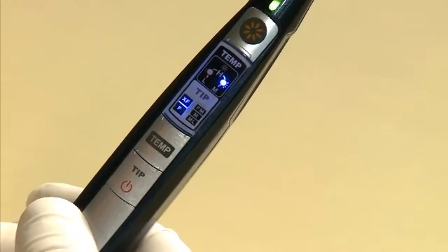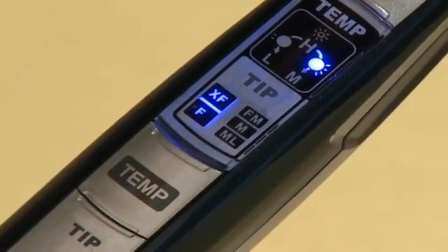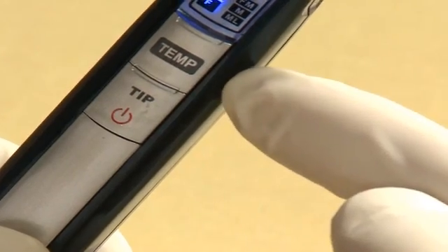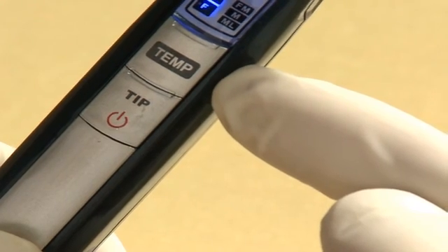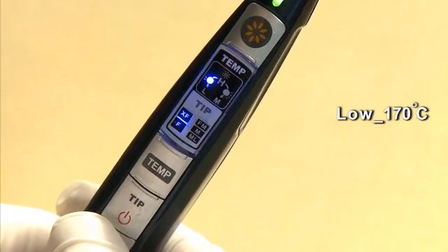The default setting for temperature is medium, which is indicated by the M indicator on the handpiece. Press the temp button, which is above the power button, to change the temperature setting. The low setting has a temperature of 170 degrees Celsius.